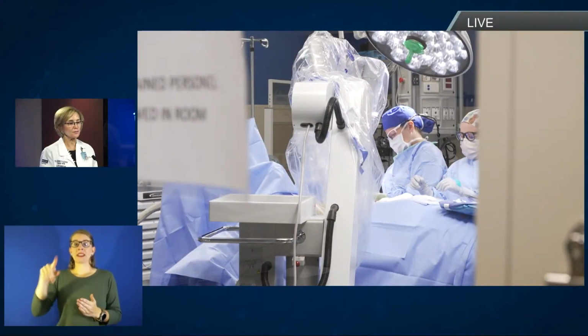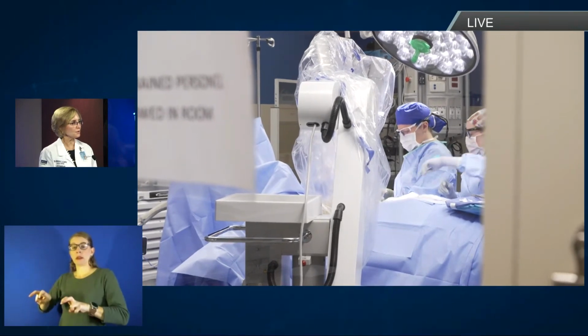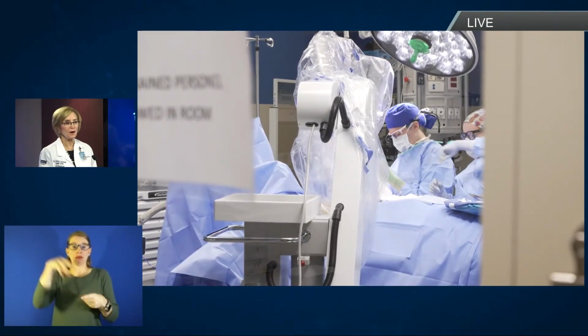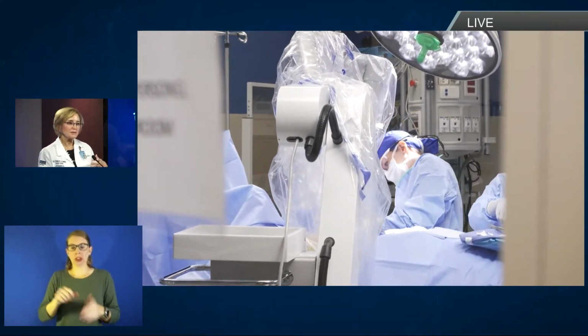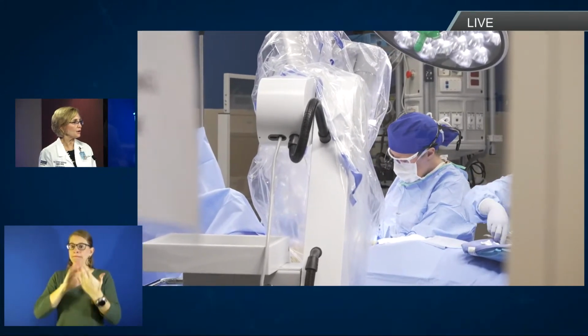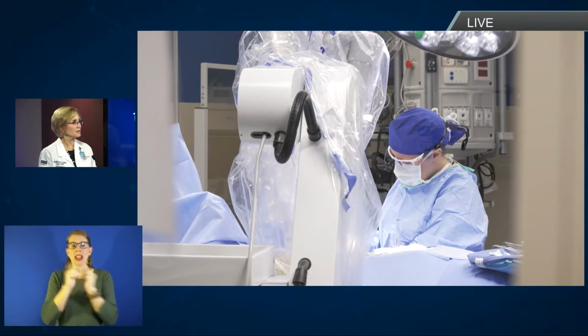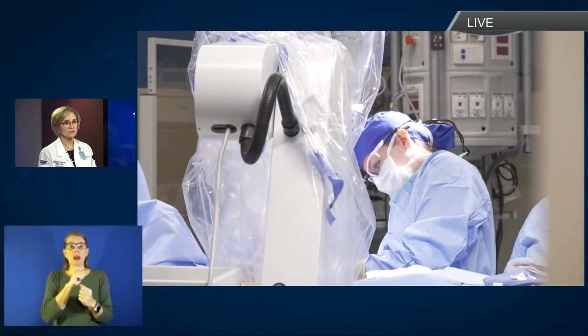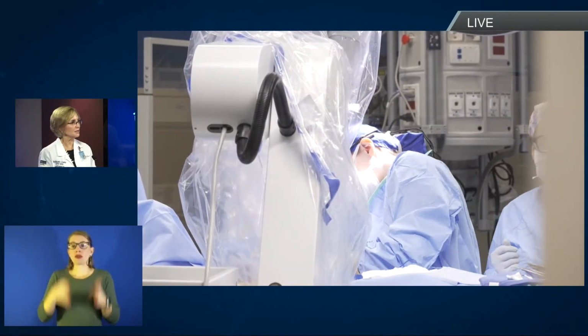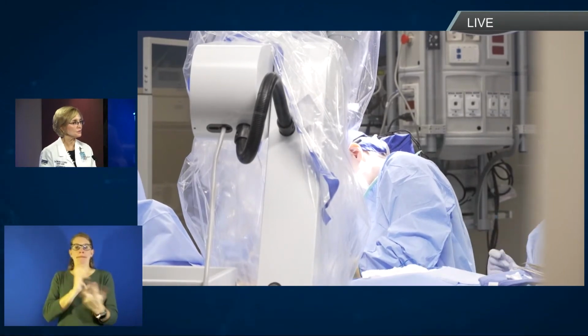So IORT is definitely a team sport, if you will, because it's championed by the surgeon. Obviously, we're doing a lumpectomy and sampling the lymph nodes at the time of the procedure, but it also requires a trained radiation oncologist and radiation physicist, which we normally would not have in the OR during a lumpectomy. So it's definitely a team effort, and we all have to see the patient beforehand. That's in our protocol, that we have consultations with both surgeon and radiation oncologist, so that we are very sure that we are selecting the right treatment for the right patients for this treatment option.